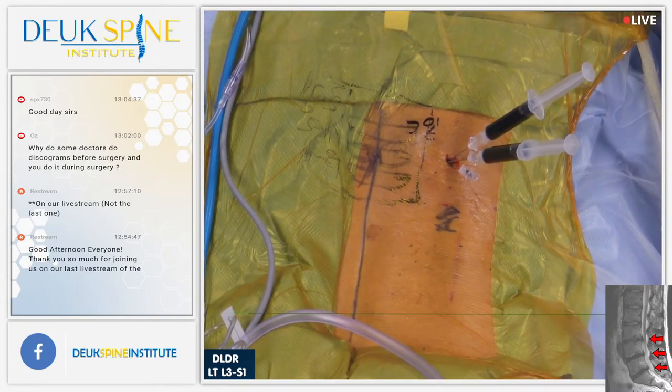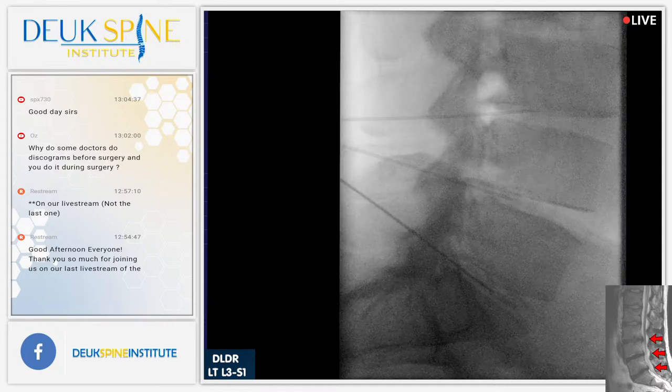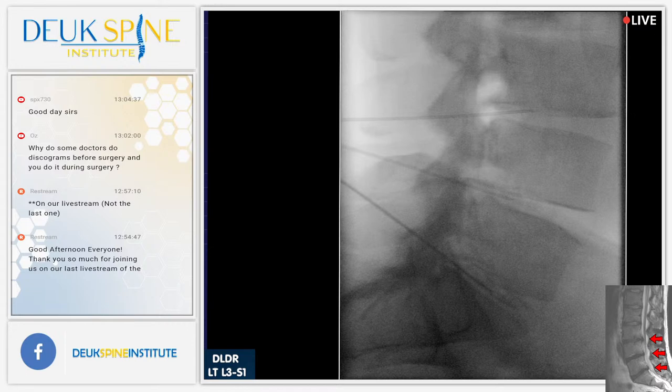Show us the tear. Take a look at this x-ray, folks. You can see the tear in the back of the disc. See the white arrow showing you the tear? All right, settle down. Now, it was only a 7 out of 10 at L5-S1 because the dye all leaked out through the tear. I couldn't get any pressurization. Normally, you need a little pressurization, but I couldn't get any. Is that better? He said, yeah.